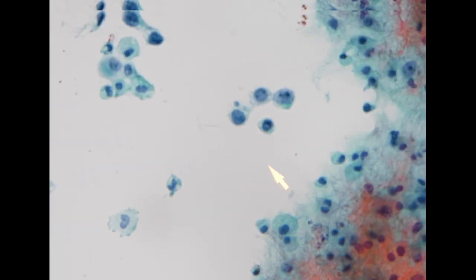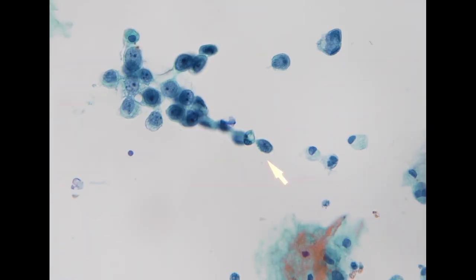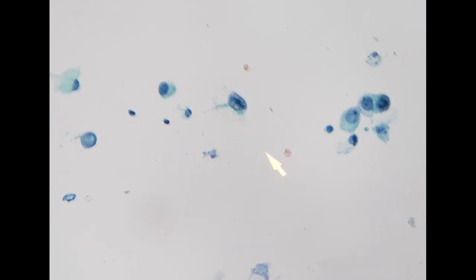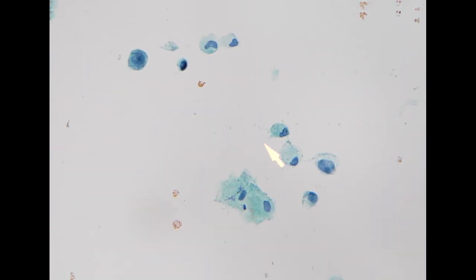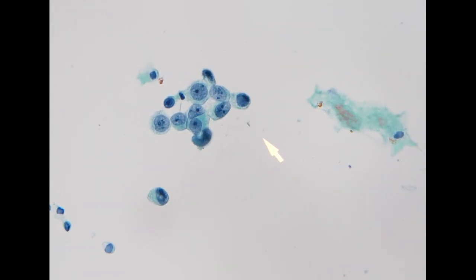So initially for this relatively young patient, I was still thinking about lung cancer, because rarely we can have lung cancer in a young female, and this is a pleural effusion specimen. Although, just like what I said before, it is not so common that we will have the initial presentation of these poorly differentiated forms, like single cell lung adenocarcinoma. It accounts for possibly less than 10% of our initial presentations.